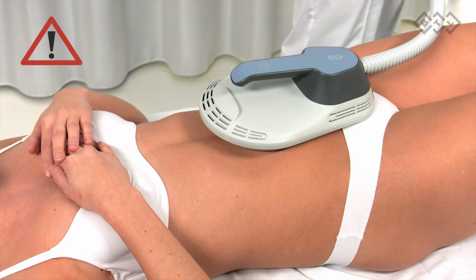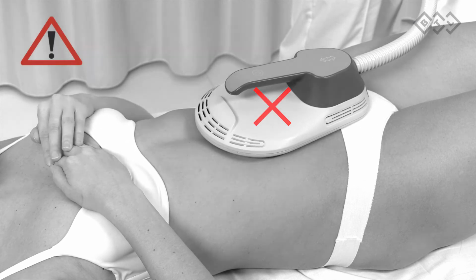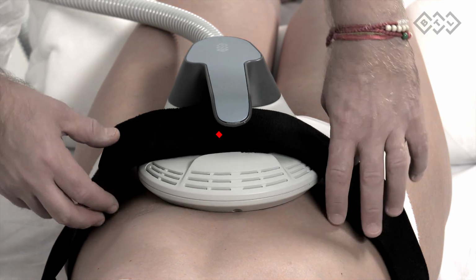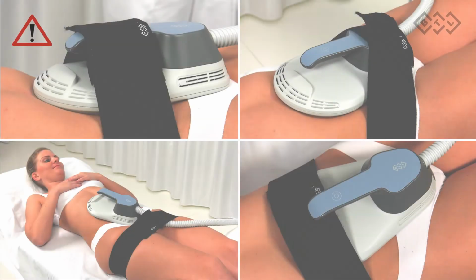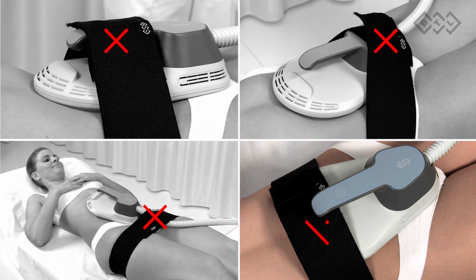The applicator is not secured by the fixation belt. The fixation belt is not tight enough. The fixation belt is placed incorrectly.